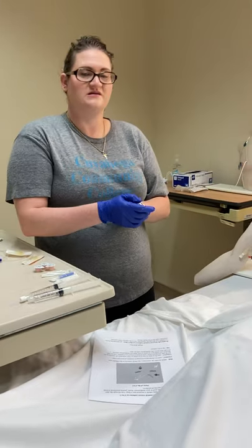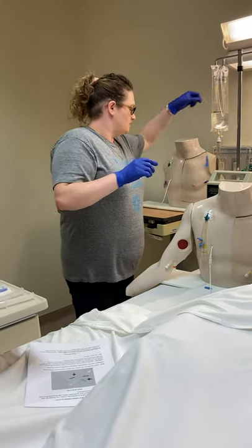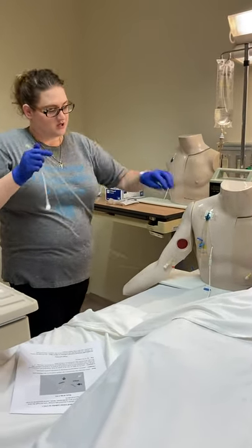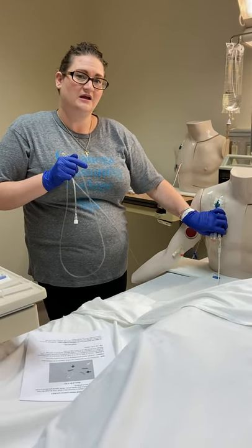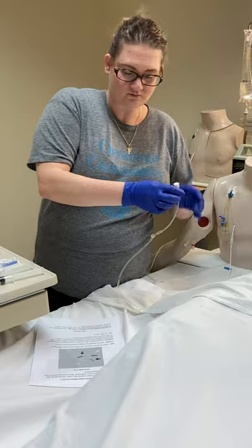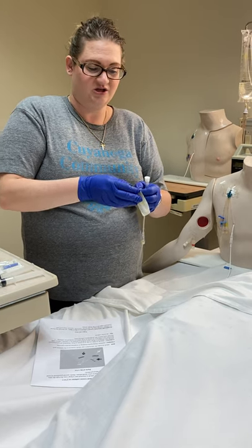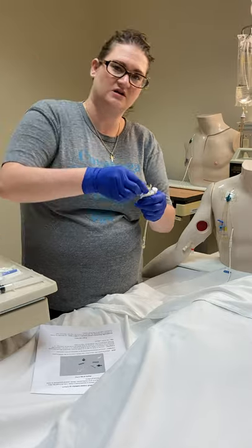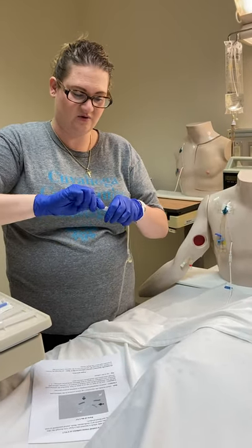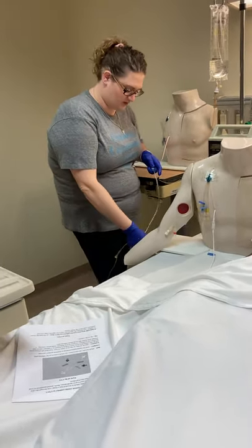We're going to go through essentially the same process that we did with our peripheral IVs, focusing on our triple lumen. I've already primed my primary line. Now we're using simple connectors here, so I'm going to need an alligator clamp in order to access this — these are not going to screw on. I need to make sure the alligator clamp is on there and that it primes all the way through so we're not giving our patient any air. We just peel like a banana to maintain sterility.